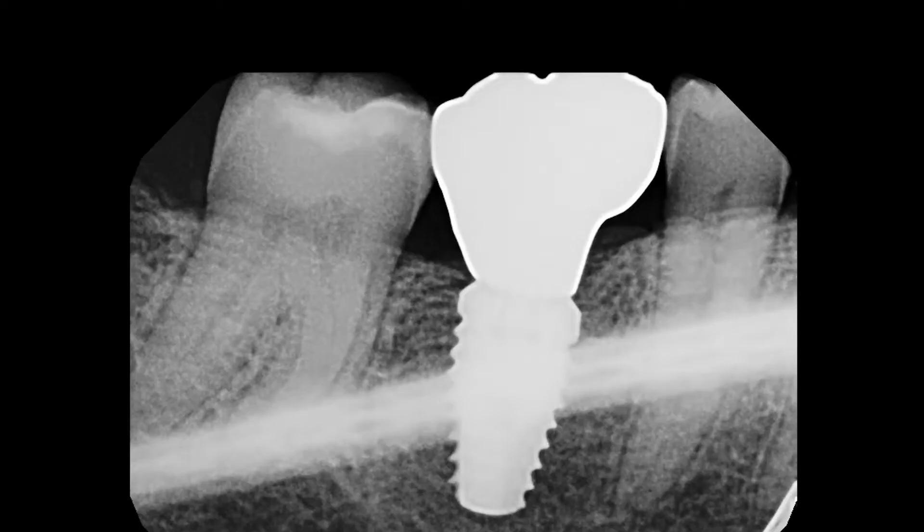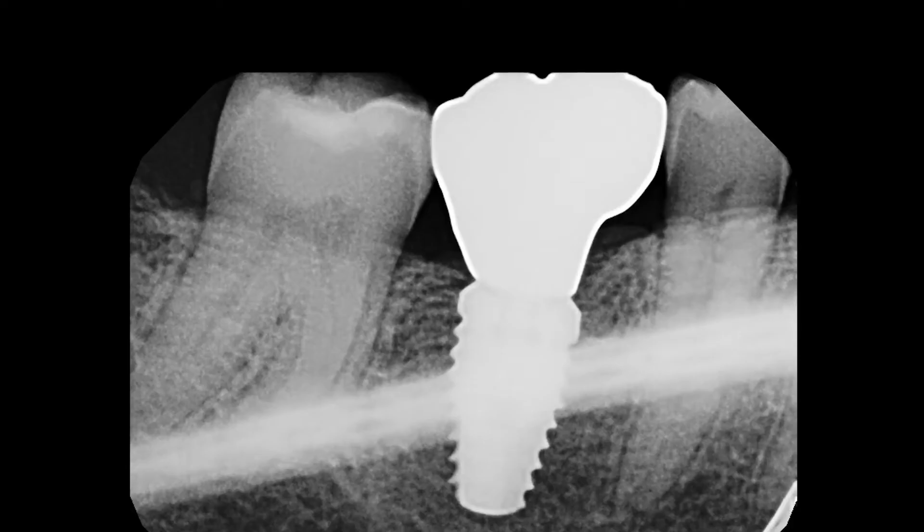If you see one of these, what's your contingency? You make sure that the mesial margin ridge is out of contact. It's not ideal, as food will still push in on it, but you can reduce the risk by keeping heavy contacts off the mesial margin ridge. Keep your contacts right over the center of the implant. However, there's a better way to mitigate this risk: don't make a Snoopy in the first place.